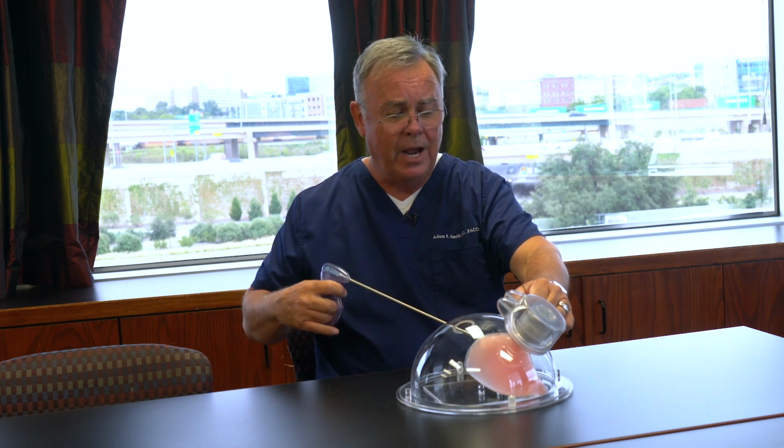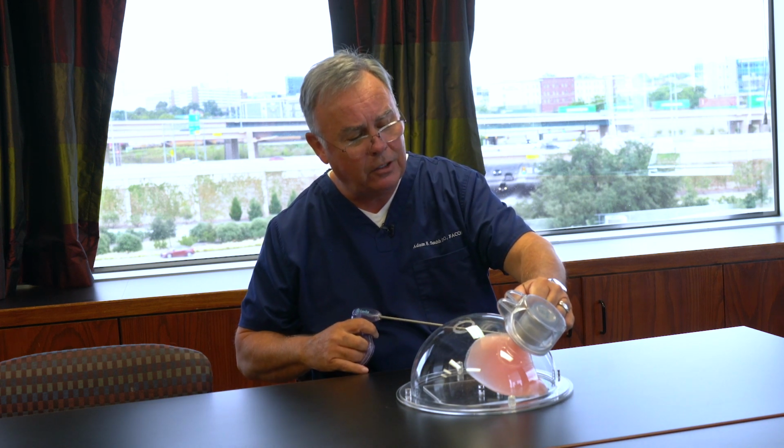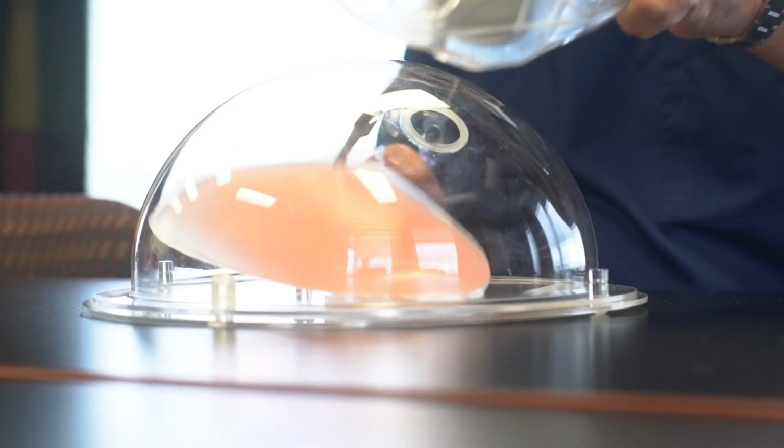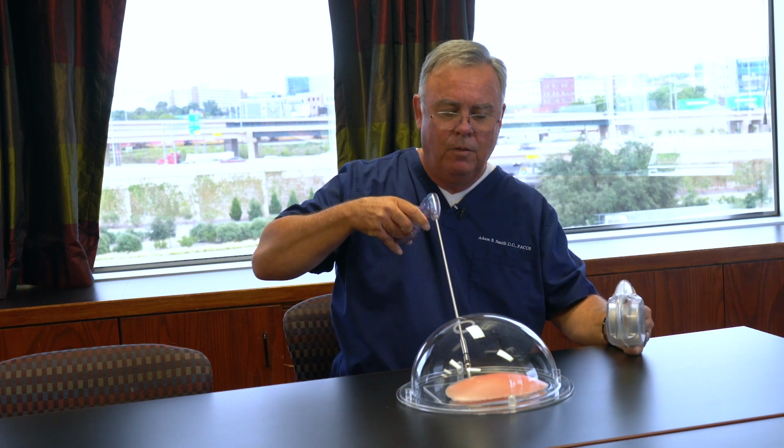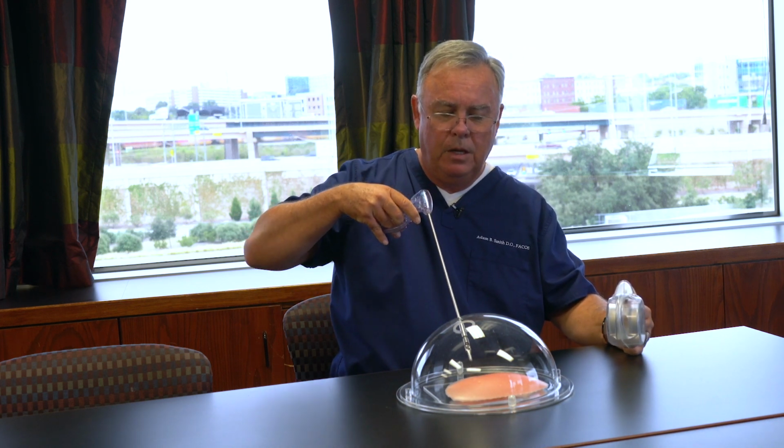Then when it's time for the surgery to be over, we're going to go back in and we can reconnect our technology. We remove the magnet. Obviously the tissue doesn't slam down like it does in our model. We remove the magnet, remove it from the tissue, and voila, we're done.